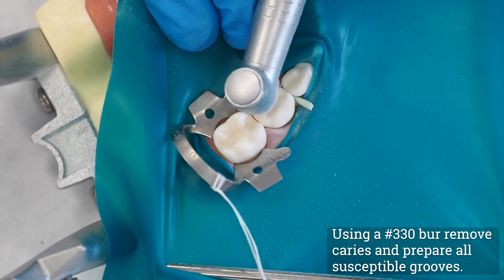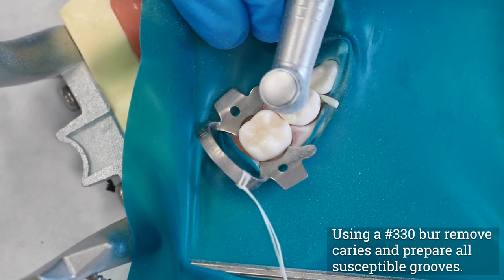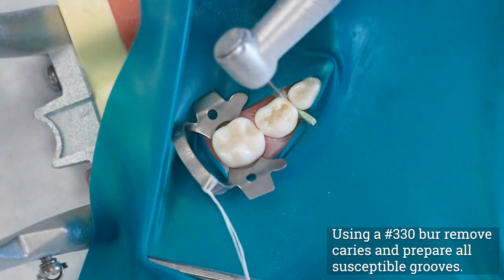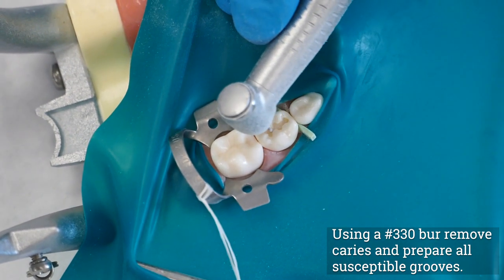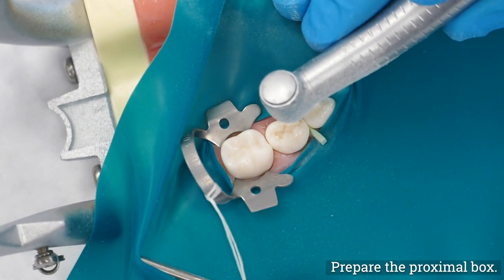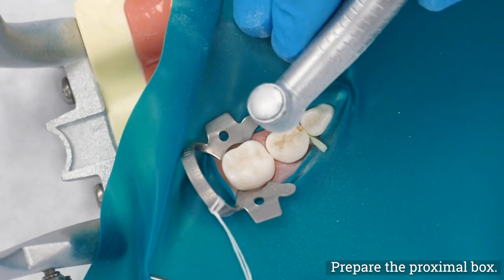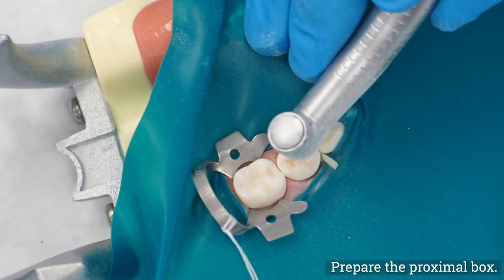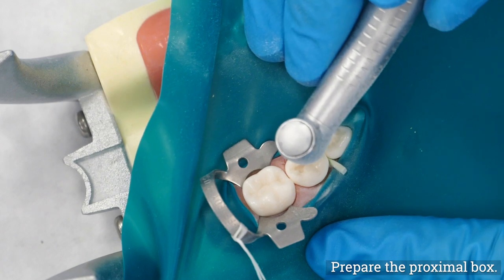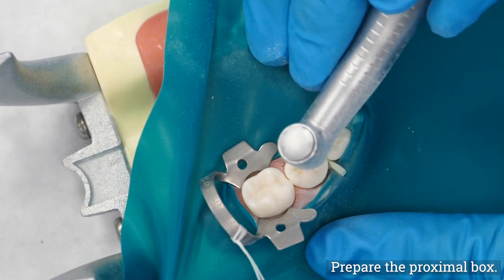Using a number 330 burr in a high-speed handpiece with a light brushing motion, remove caries and prepare all susceptible grooves. To prepare the proximal box, begin at the marginal ridge by brushing the burr buccolingually in a pendulum motion and in a gingival direction at the dentin-enamel junction. Continue until contact is just broken between the adjacent tooth and the gingival wall and the wedge is seen. If the gingival wall is made too deep, the cervical constriction of the primary molar will create a very narrow gingival seat. Take care not to damage the adjacent proximal surface.